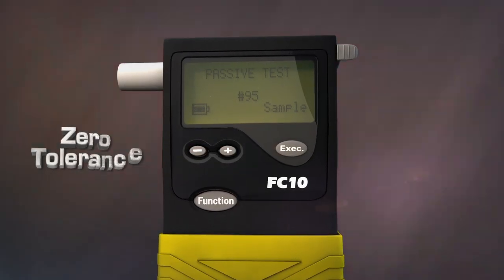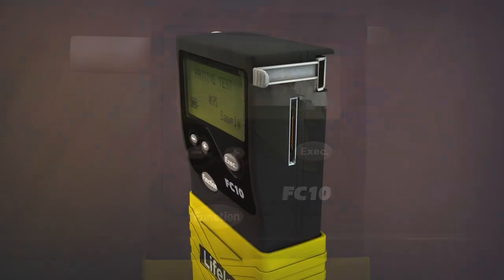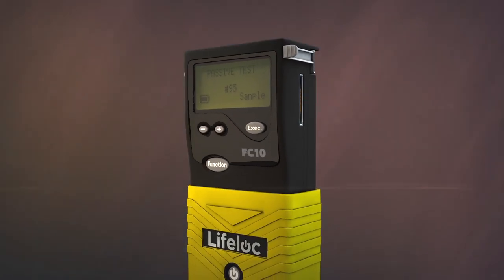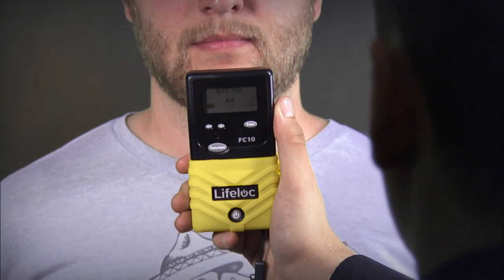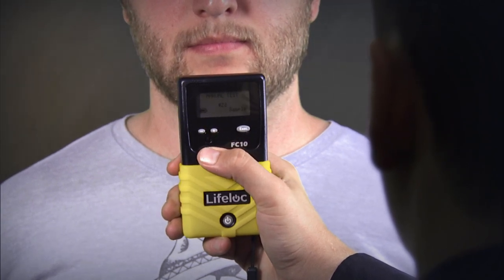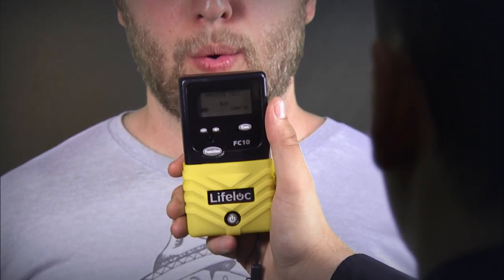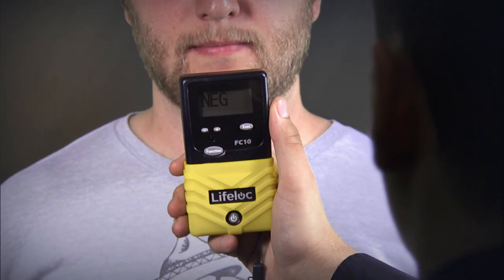Passive testing is for zero tolerance situations where no amount of alcohol is acceptable. It's also used for testing open containers for the presence of alcohol. No mouthpieces or special attachments are required — the FC automatically draws a sample of the subject's breath into the test chamber and gives you an immediate positive or negative result for alcohol.